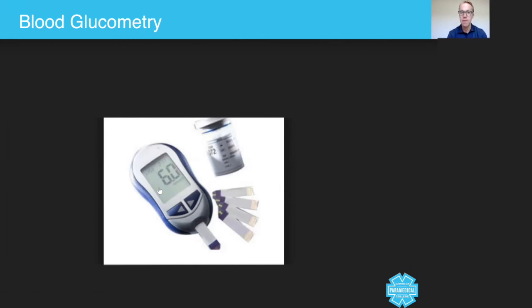And other things to think about are hand decontamination. Before you do this, make sure you decontaminate your hands, put your gloves on, have the sharps bin ready, because the lancets that actually prick the finger are treated as a sharp.